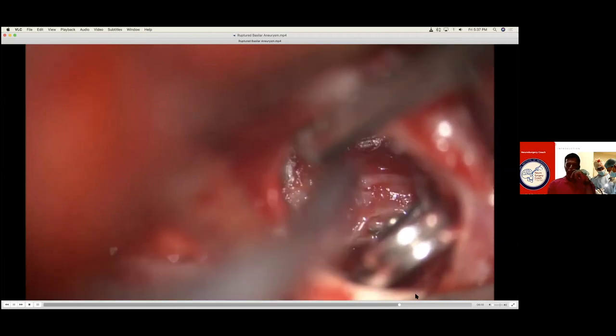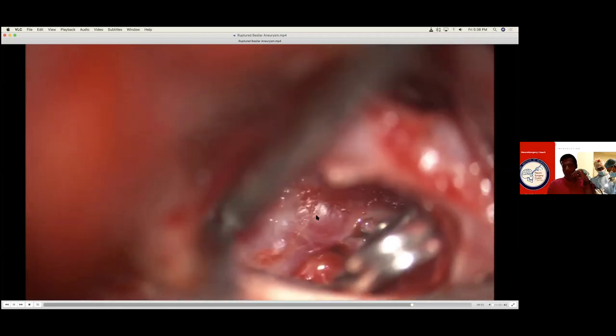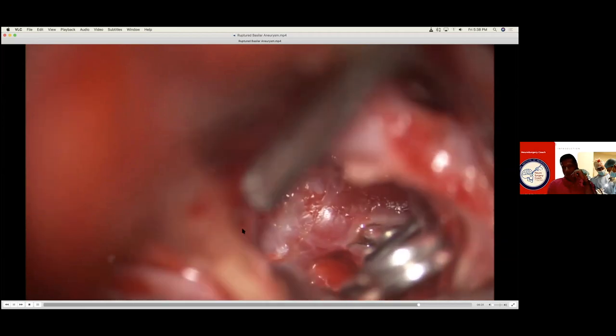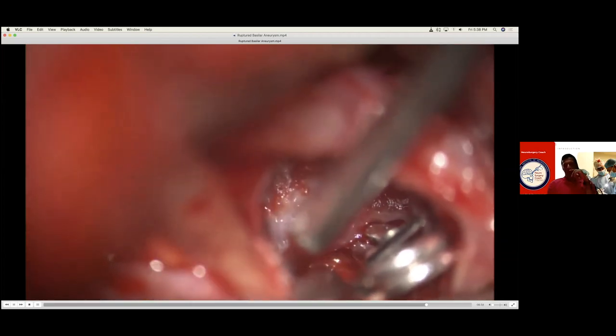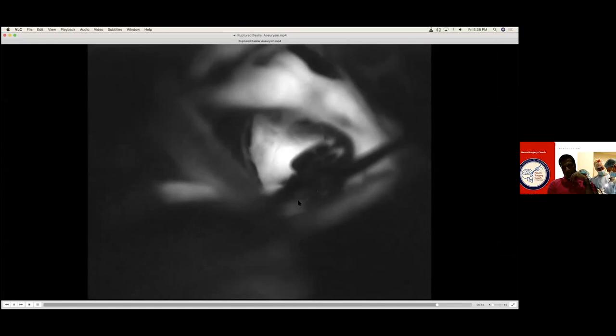That is your basilar tip. You can see the superior cerebellar, the P1, basilar tip, that is the basilar, and that is the interpeduncular system — that's the brainstem, the midbrain coming right at you. That's a clipped aneurysm — P1 with absolutely no filling. I like to go all around again, seeing everything. You have to make sure — if you need to take out your clip at this point, you have to take it out. There are many times you do a beautiful clipping for basilar and the patient never wakes up because you clipped something. That is your carotid, that is your basilar, absolutely everything looks all right, nothing filling distal to the clip. P1 here, superior cerebellar, P1, basilar trunk.